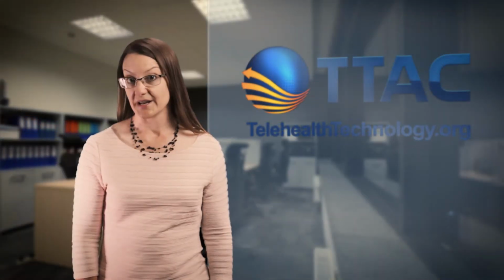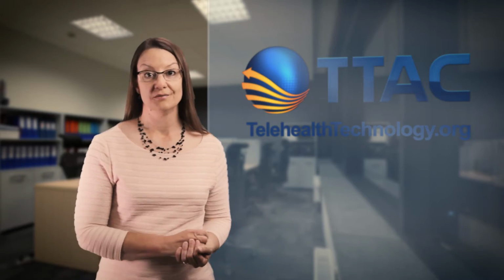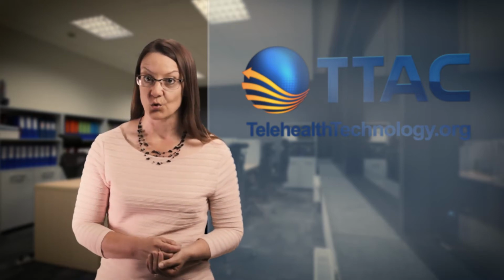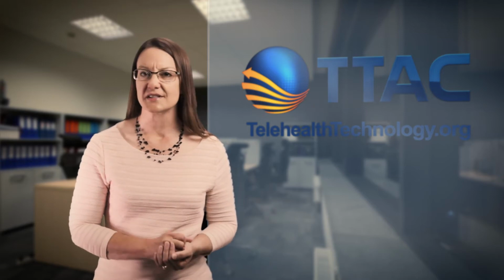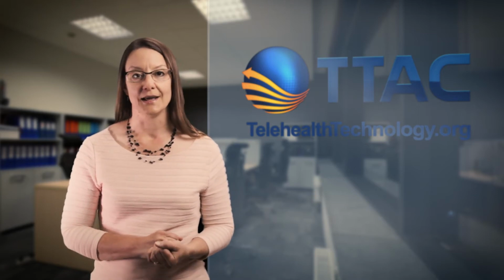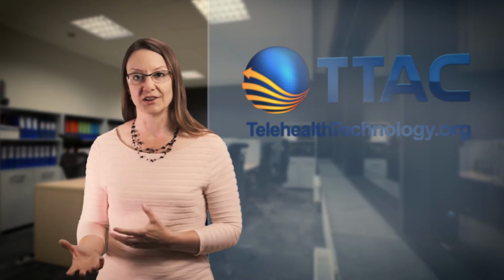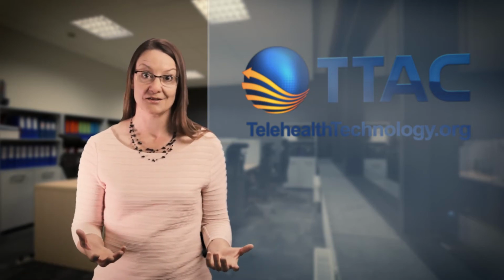If you're in an area where data speeds are questionable, you may experience packet loss, jitter, and other issues unrelated to the quality of the stethoscope, but critical to the quality of the audio. This is again why we recommend testing in your host environment. Time and again, we've found that what works great in our lab doesn't always work well on a messy hospital network or on the public internet.